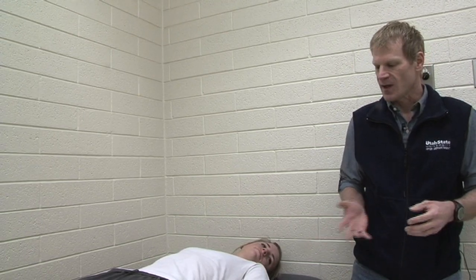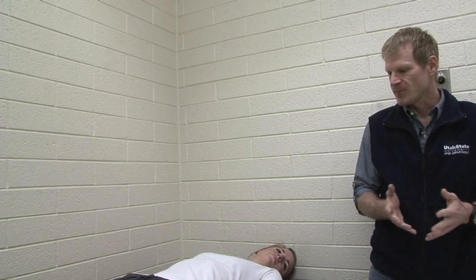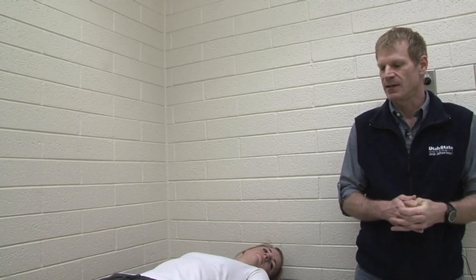Certain advantages to this method: as you can see, it's simple to use, simple to set up, and easy for both the technician and the client. It's also a good method for obese people — it's not dependent on body fat. The disadvantage to this method is that it's very dependent on hydration state. Because electrical conductance is based on the amount of hydration a person has, if a person is over-dehydrated or hyper-hydrated, that could give us an errant reading.